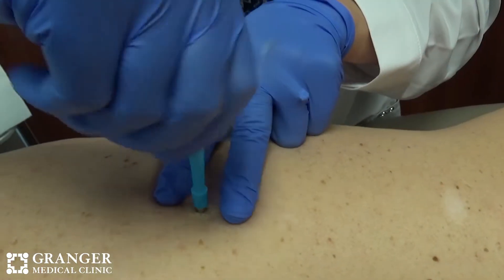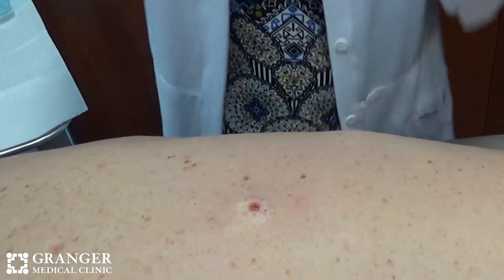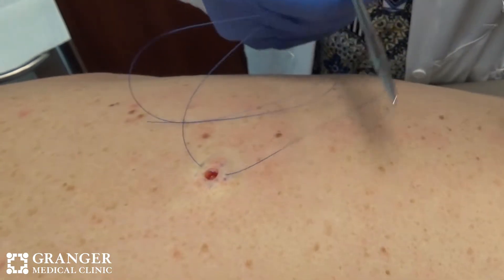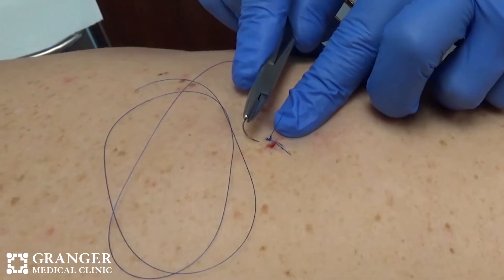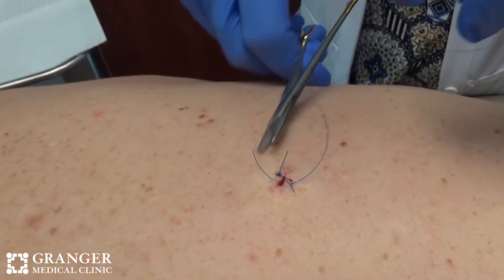A punch biopsy is quite different — it's essentially a cookie cutter, and I'll demonstrate what that looks like. I'm cutting the area out, so if it's a dark area that's flat, generally we want to get the whole lesion out. If it's small enough I'll take it out with a punch biopsy, or if I have a cyst I can get out with a punch I'll do that. I also do a lot of evaluation of rashes the same way — if I need more information from a biopsy, I'll do a punch biopsy, and you will leave with stitches if I do one.